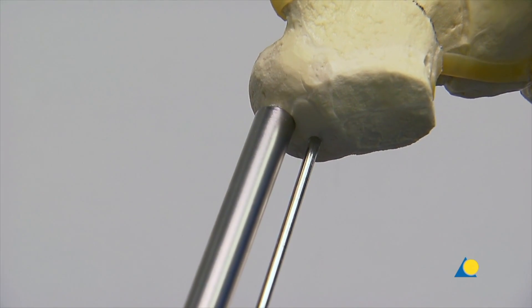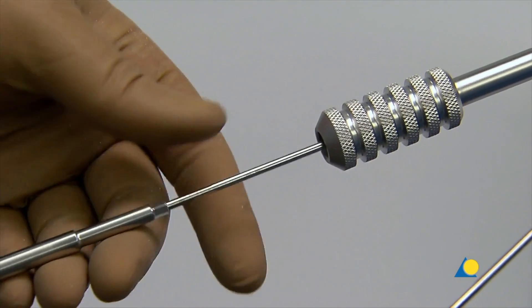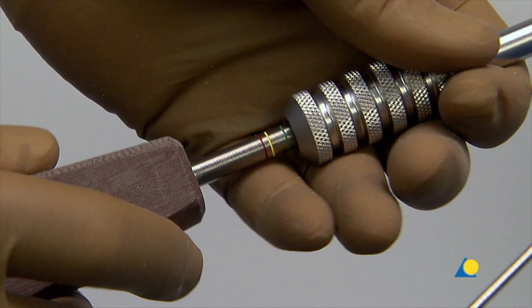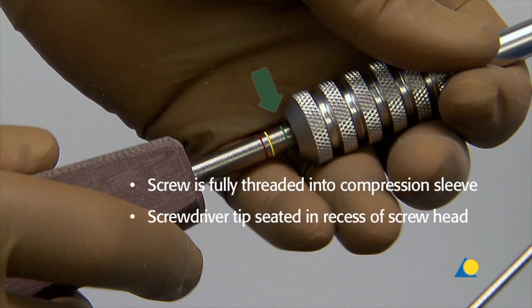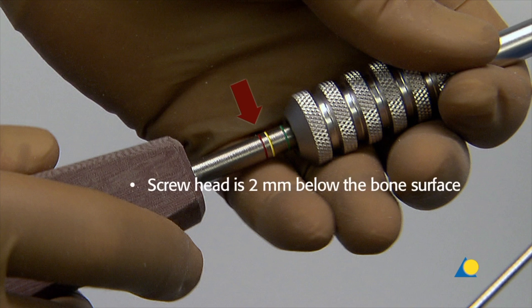Once the appropriate compression is achieved, the sleeve handle is removed, and the cannulated screwdriver is slid over the guide wire into the sleeve. The colored rings on the screwdriver shaft indicate the position of the screwdriver tip and the position of the screw head in the bone. When the green ring is level with the compression sleeve, the screw is fully threaded into the compression sleeve and the screwdriver tip is seated in the recess of the screw head. When the yellow ring is level with the compression sleeve, the screw head is flush with the bone surface. When the red ring is level with the compression sleeve, the screw head is 2 mm below the bone surface.